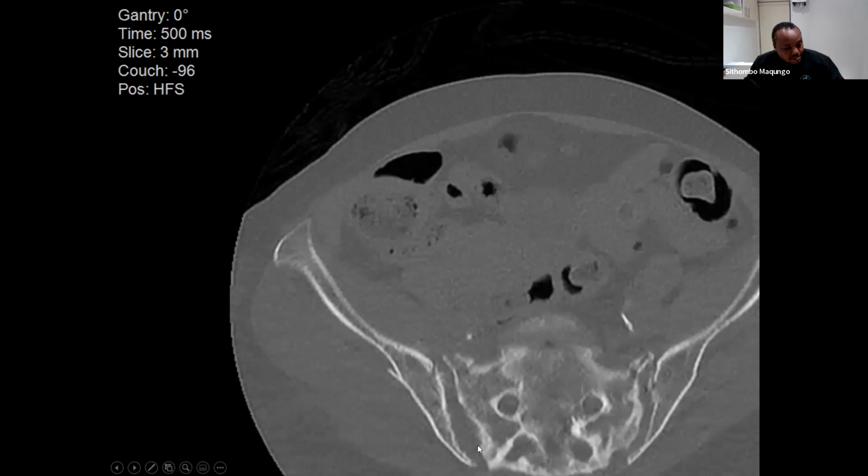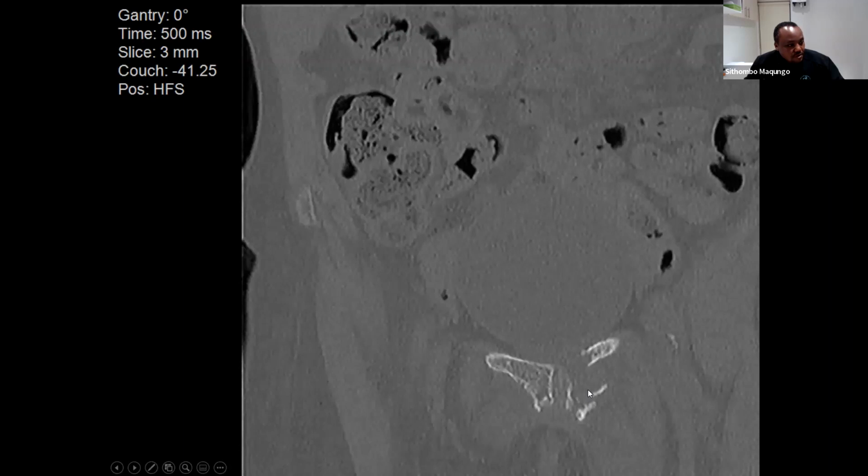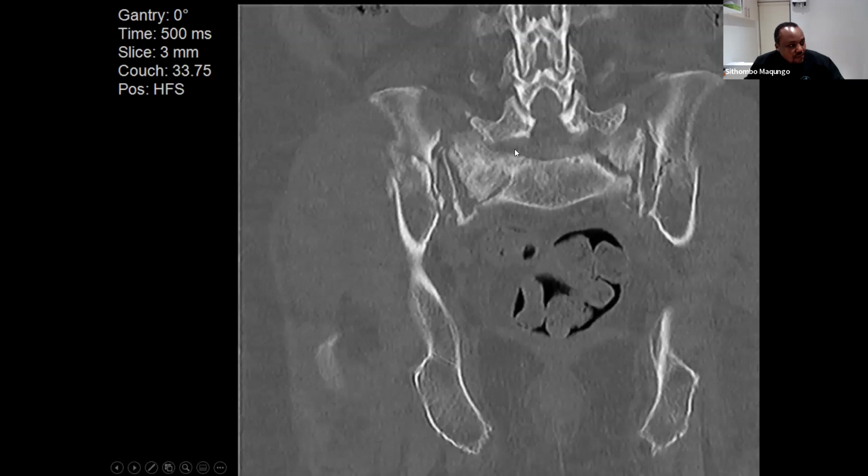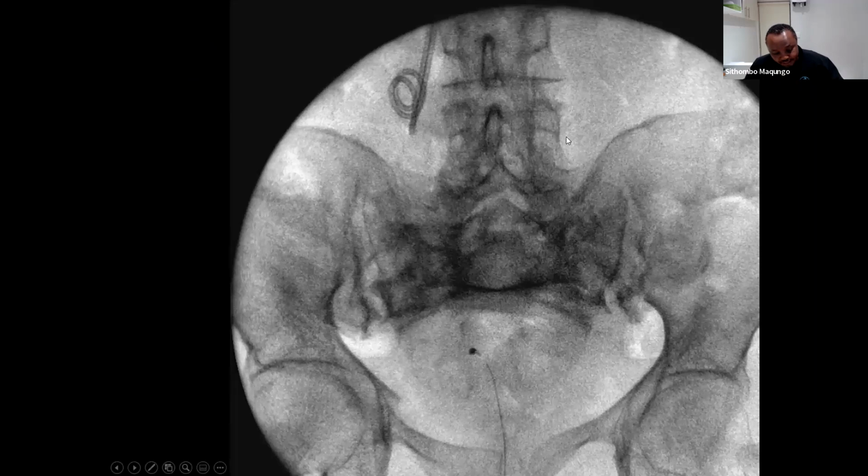That's the anterior pelvis, confirming the presence of a non-union in the left superior ramus. Again, another non-union at the right superior ramus that we saw earlier on. But importantly, this is the posterior component, where there's involvement on both the right and left sides of the pelvis posteriorly. Now, the difficulty is that this is the image you get when you screen in theater, because with advancing disease, the spine basically invaginates into the pelvis and your landmarks get messed up completely. That's the price you pay for intervening late.